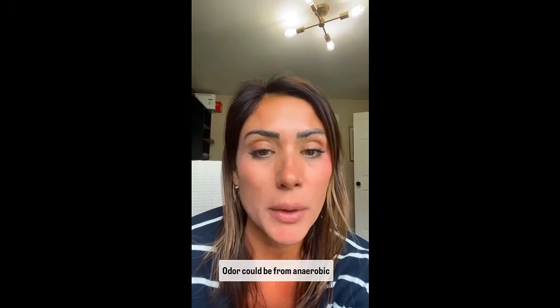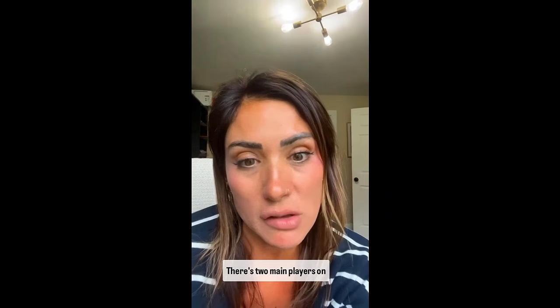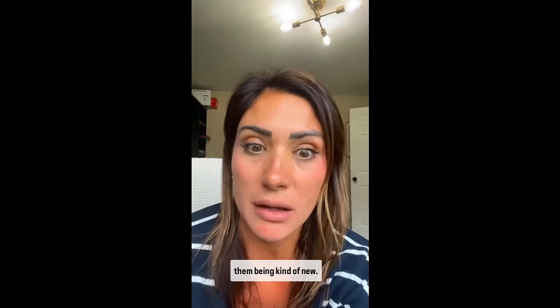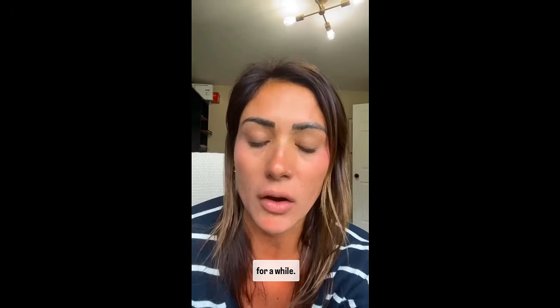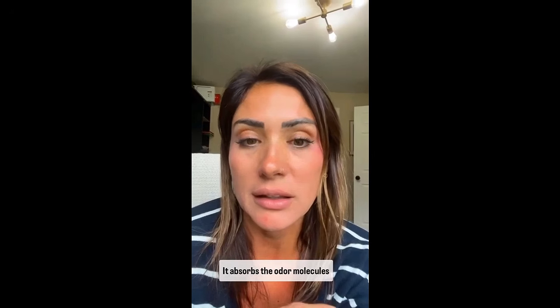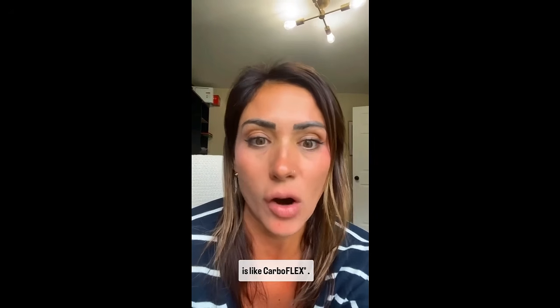Odor could be from anaerobic or aerobic bacteria as well as necrotic tissue. There's two main players on the market today, with one of them being kind of new. So the first is activated charcoal. That's been around for a while. It absorbs the odor molecules to mitigate the smell. An example of this dressing is Carboflex.